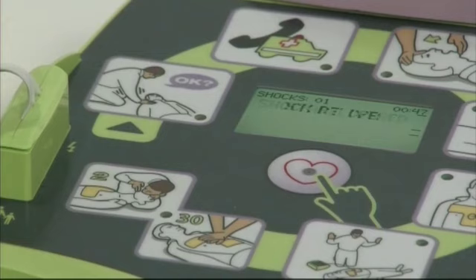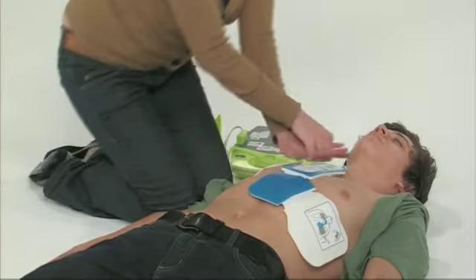The AED Plus will confirm that a shock has been delivered, and then advise you to start performing CPR.